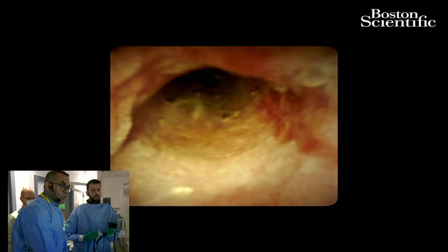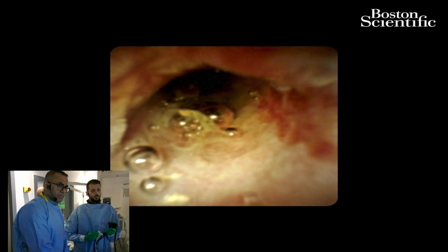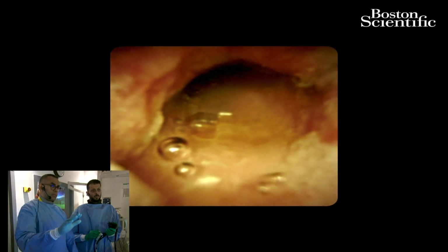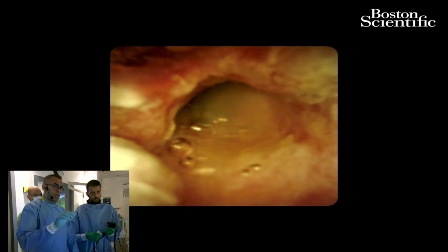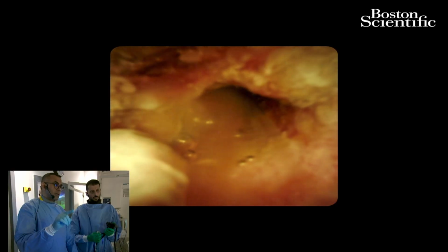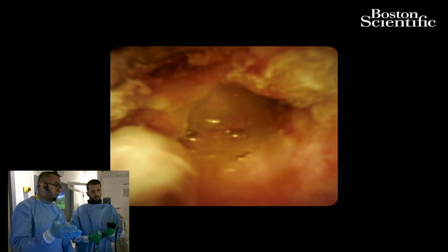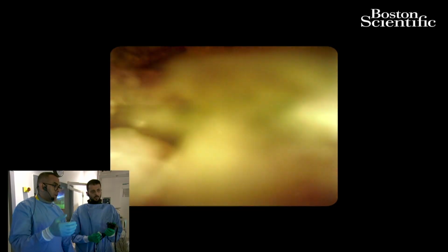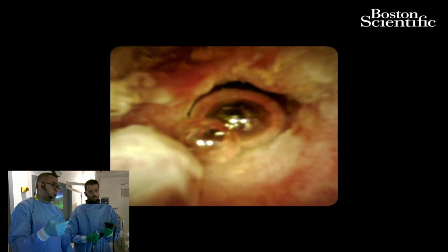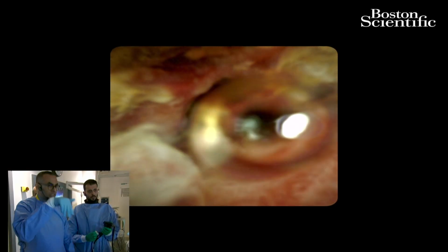Okay. Yeah, I think now we can see that it's more like, I don't know if you all agree, an inflammatory change at the moment, maybe with the effect of the stent. And there is a question, Dr. Hamad. Yes. Okay, if I may mention something really quick. The types of cholangiocarcinoma you would appreciate are papillary, nodular, or infiltrative type.